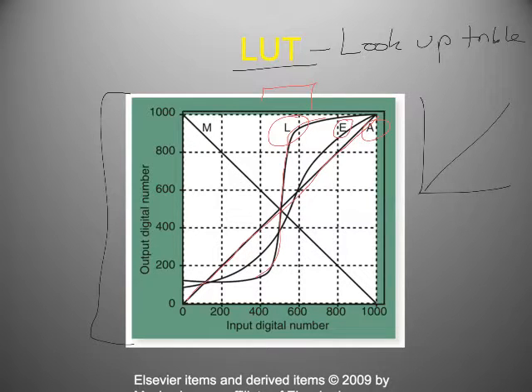Like if you look at, for example, this line M here, can anyone take a wild guess? What might line M do? Sometimes it's called black bone, but if you've ever been playing around in fluoro and they switched everything around, to where the bone is now black and the air is now white, that's what this lookup table direction would do. It would switch everything around. It would flip the whole image inside out. So we primarily use them for the control of contrast, but they can also do things like black bone.